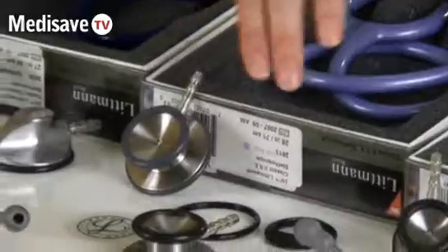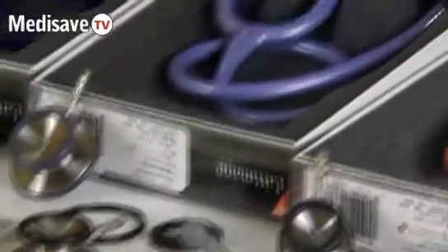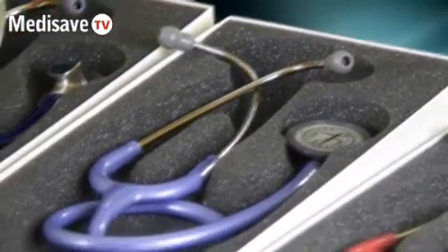Talking about the Classic 2SE, you'll see that we have a spare chest piece, diaphragm, diaphragm rim. The ear tips are removable, and the binaurals can be replaced as well.